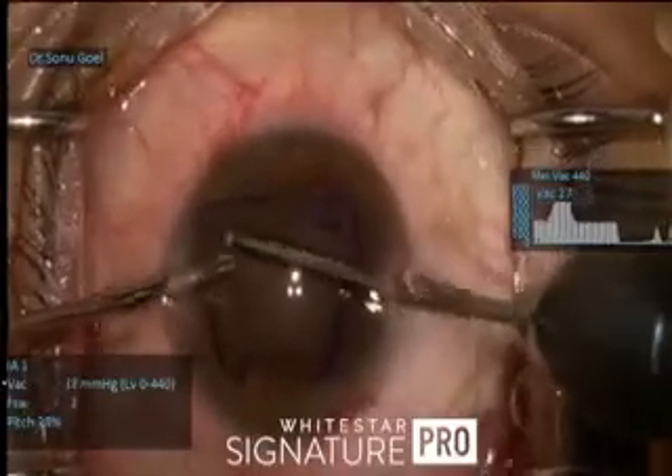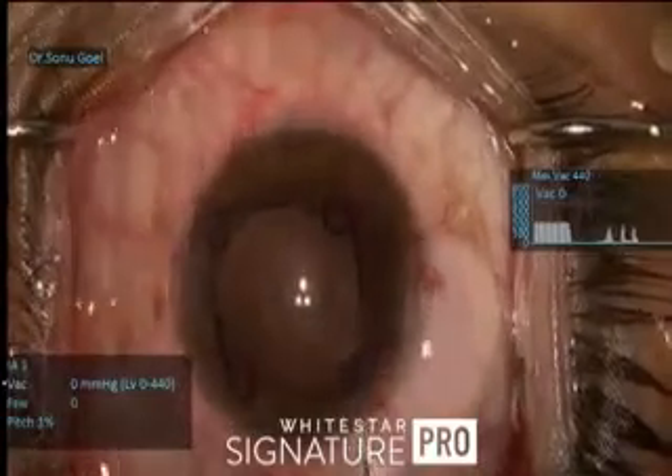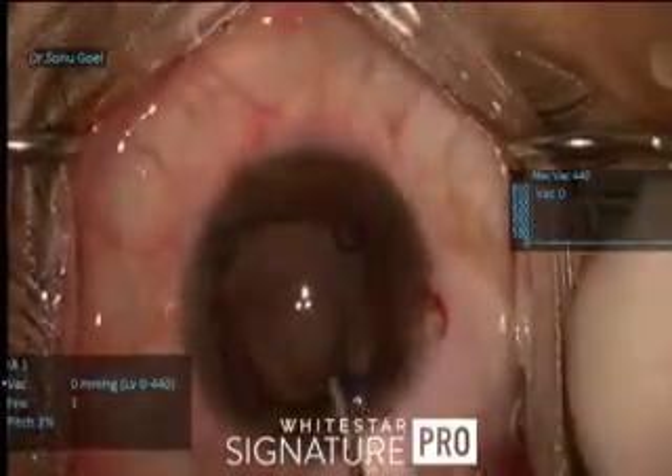I am clearing and shining the posterior capsule, going very slowly and trying to remove those lens fibers.